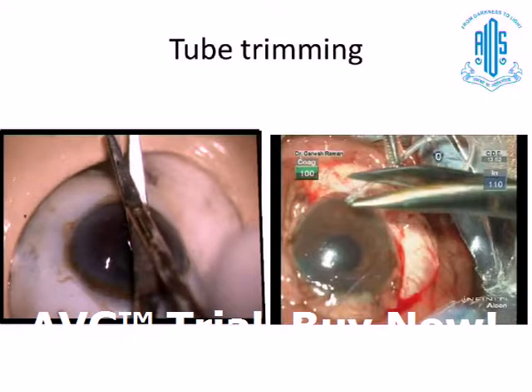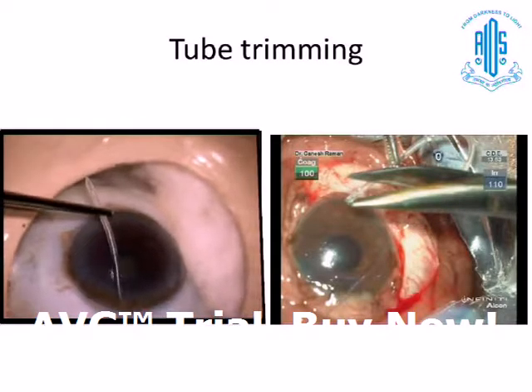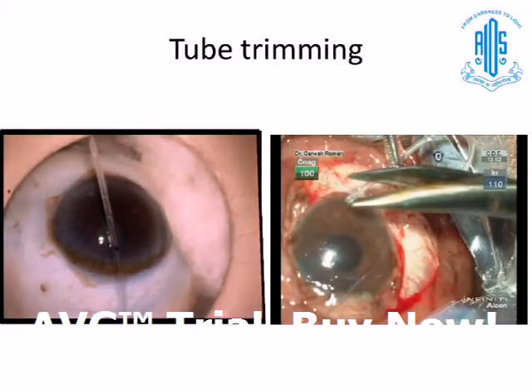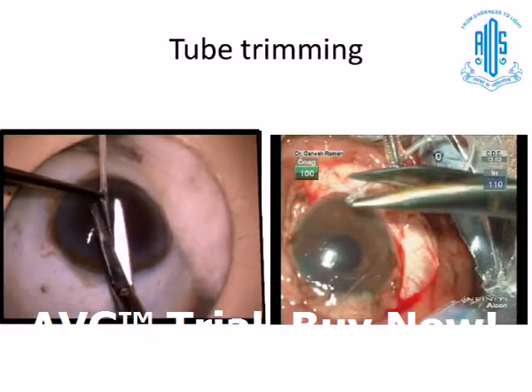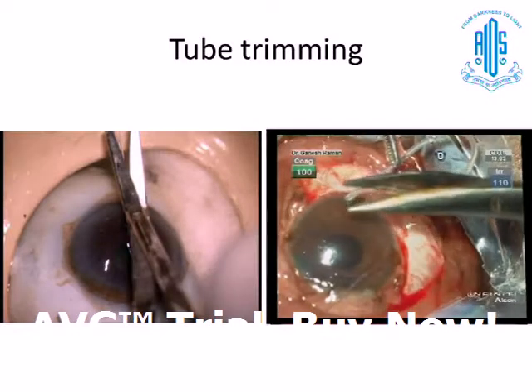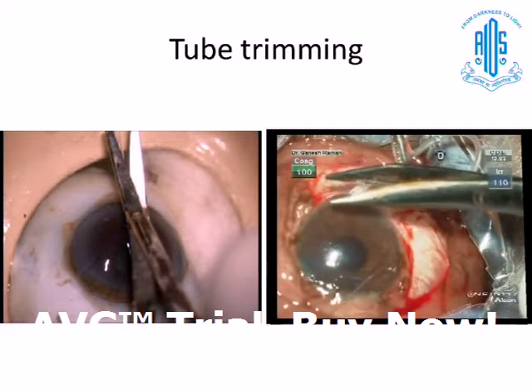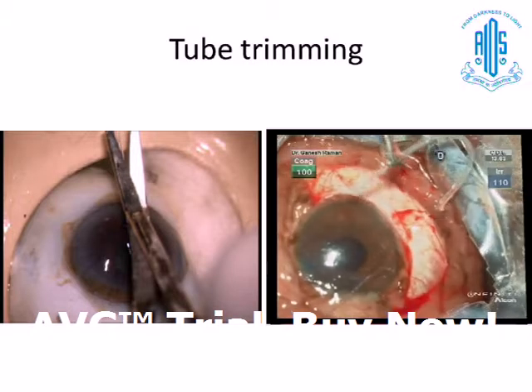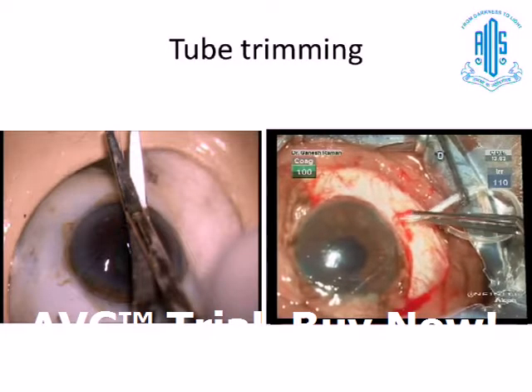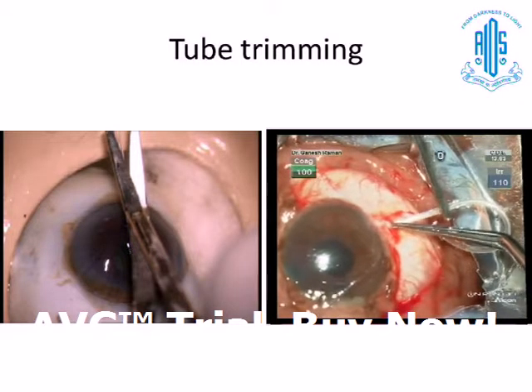Tube trimming can also be meticulously and deliberately planned — how to cut it, where to cut it. You can have the bevel facing up toward the roof, facing the floor, or facing right or left. You plan how much length to keep, and how to pull the tube and cut it deliberately, not just cut it haphazardly. For example, in this surgery the surgeon is placing the implant inferiorly, and there is an angle at which it has to be cut — this is technically difficult unless you have the sense of gripping it with the scissors and nicking it.